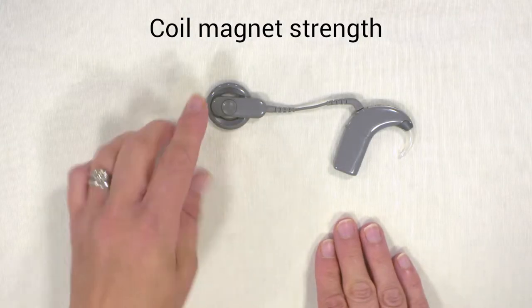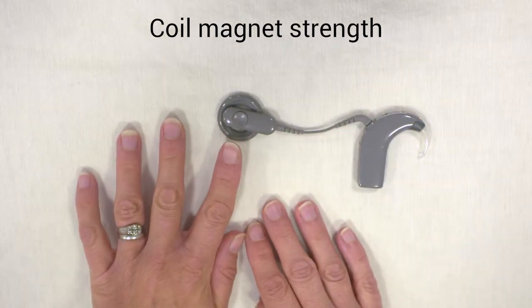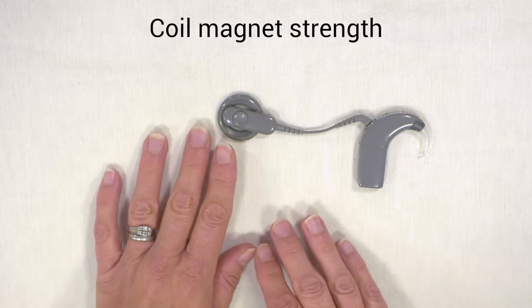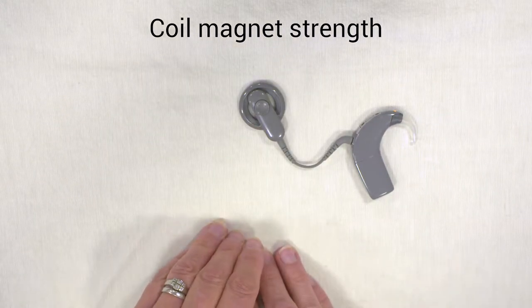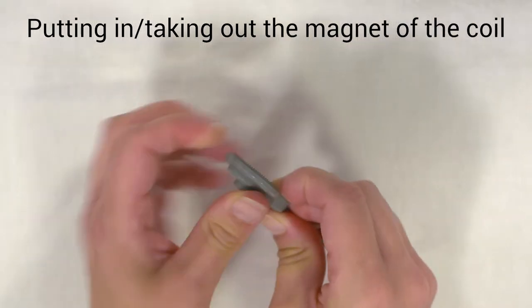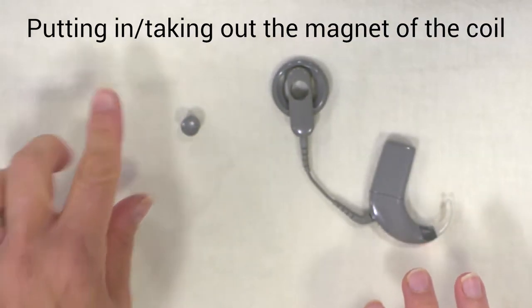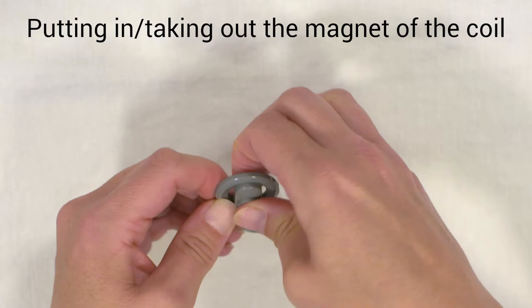Moving on to the coil — the magnet strength will be selected by your audiologist. It's quite important to get it right. If it's too strong you can cause damage to the skin, and if it's too weak it will keep falling off. So it's a fine line and your audiologist will regularly check the magnet strength. If you ever get soreness, pain or redness, you need to contact the centre because we'll need to change your magnet strength. To take the magnet out of the coil you twist it, and again twist it to put it back in.